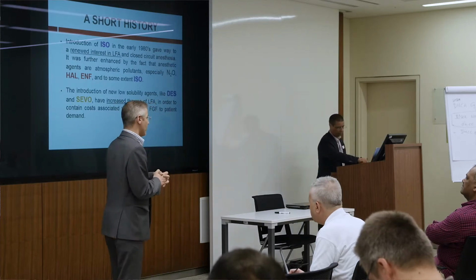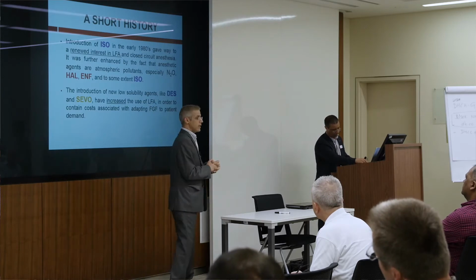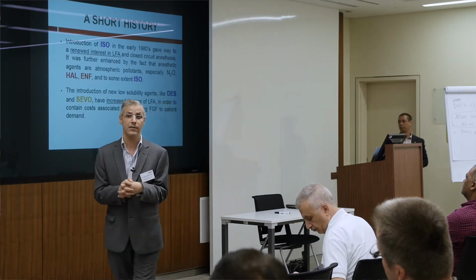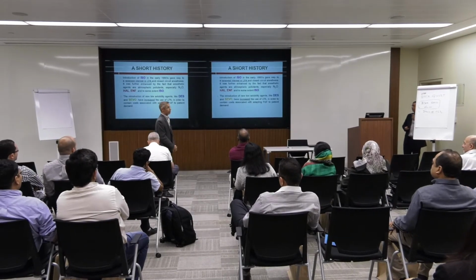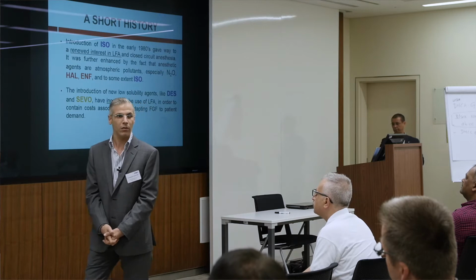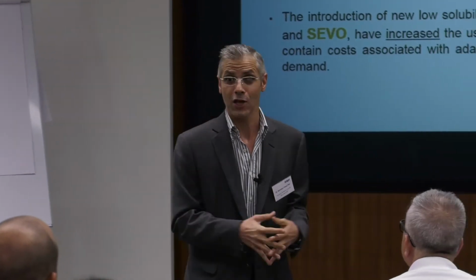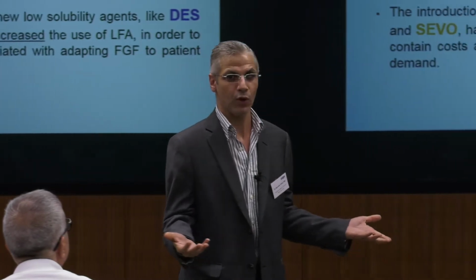Actually, it was a matter of debate for a very long time. At the beginning, they said it should be less than the patient minute ventilation. So they defined it, at the very early beginning, as less than 6 liters. By the time, they developed this definition to less than 4 liters. Later on, they said between 3 and 4 liters. After this, they said 2 liters. Then less than 1 liter. And finally, they reached less than 0.5.